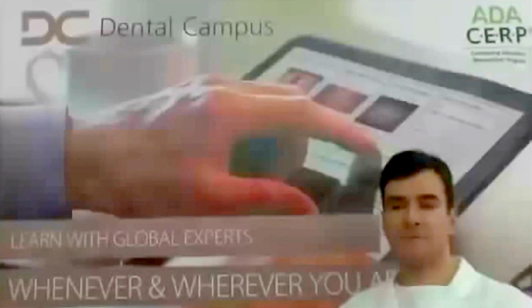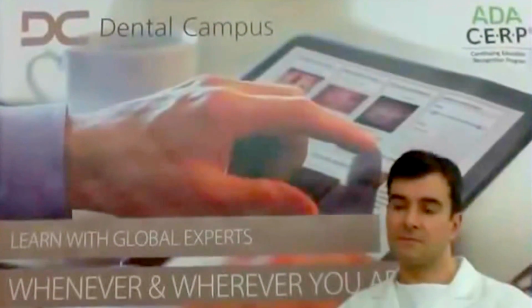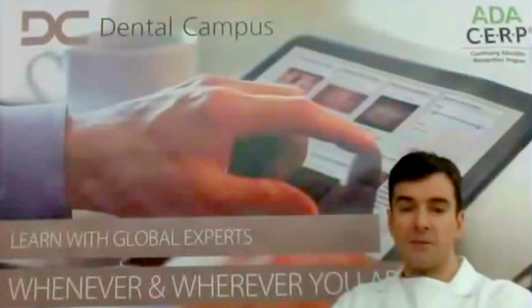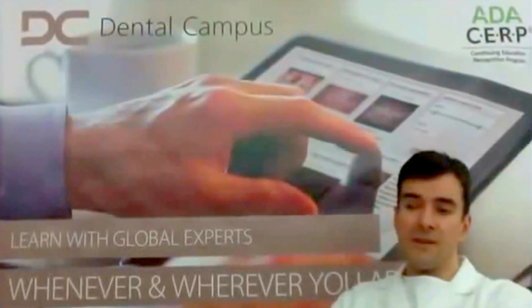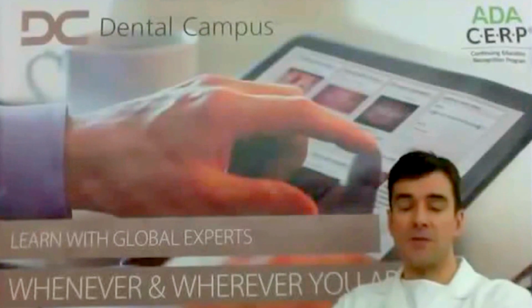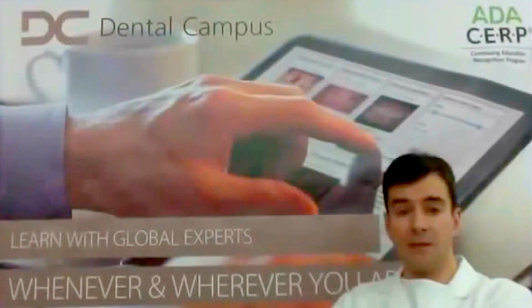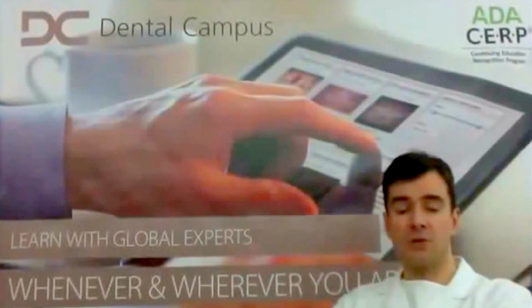In cases of thin soft tissue types, should the implant be placed at crestal level or subcrestal level? The question is, at what vertical position do we place the implant? We approach this a little bit differently in the anterior aesthetic region and in the posterior region. In the anterior region, we use different reference points, for example the cemento-enamel junctions of adjacent teeth, or the mucosal level at adjacent teeth, or the prospective margin of our crown, which we can plan by using a surgical template.